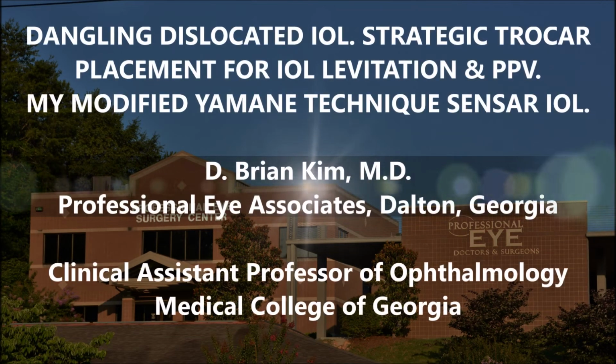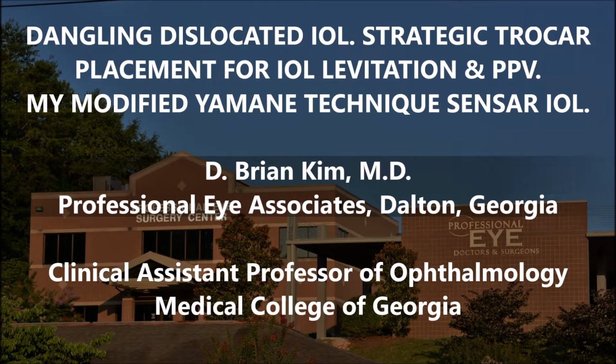I want to share with you this case of a patient who has referred to me. This patient had a dislocated IOL, a dangling dislocated IOL, due to a direct trauma to the eye. The patient ended up with a complete dislocation of the lens and bag complex. And you're going to notice that the lens is dislocated infranasally. This is the left eye.